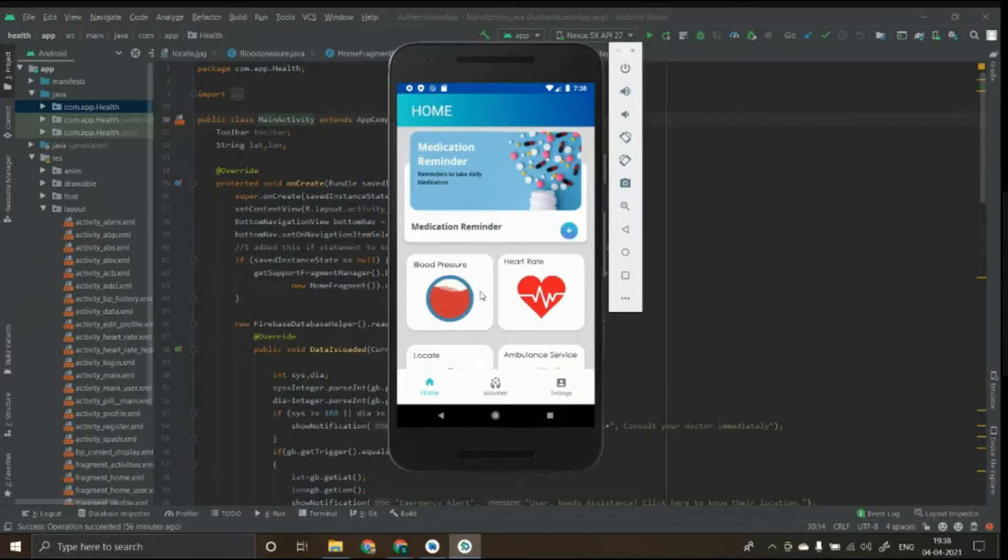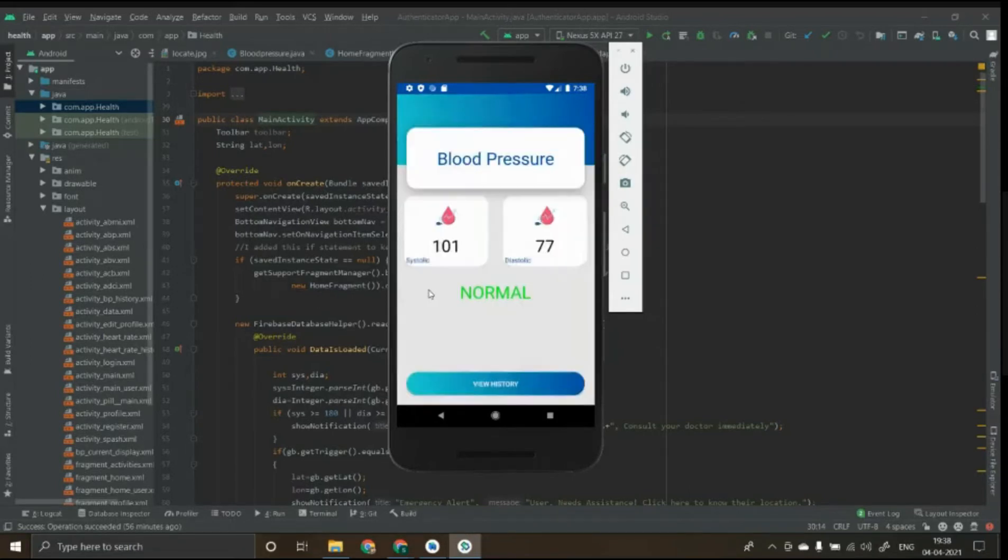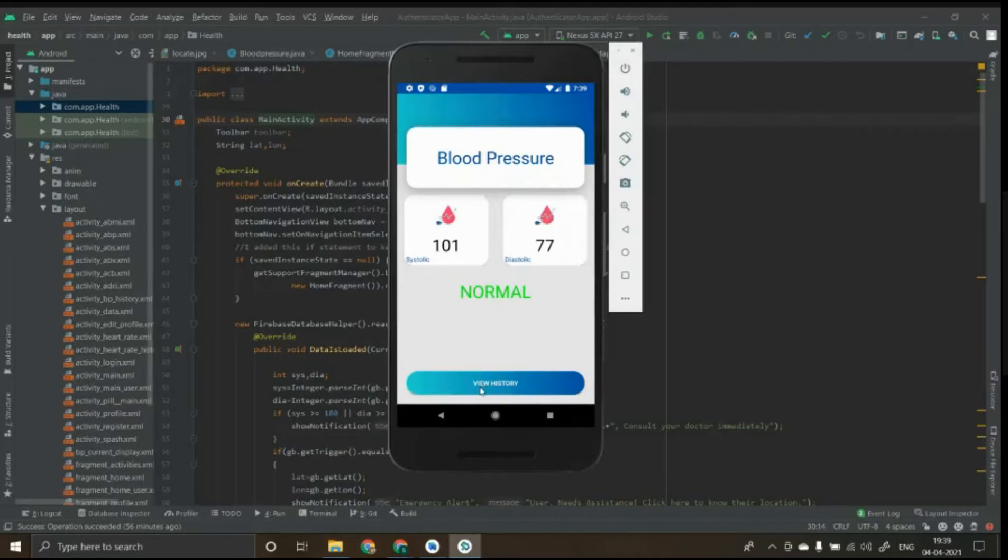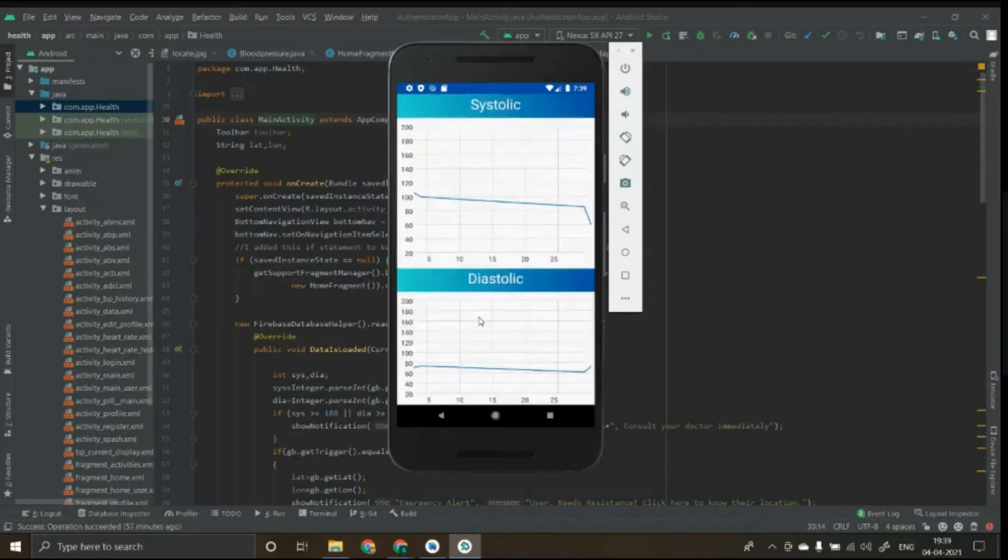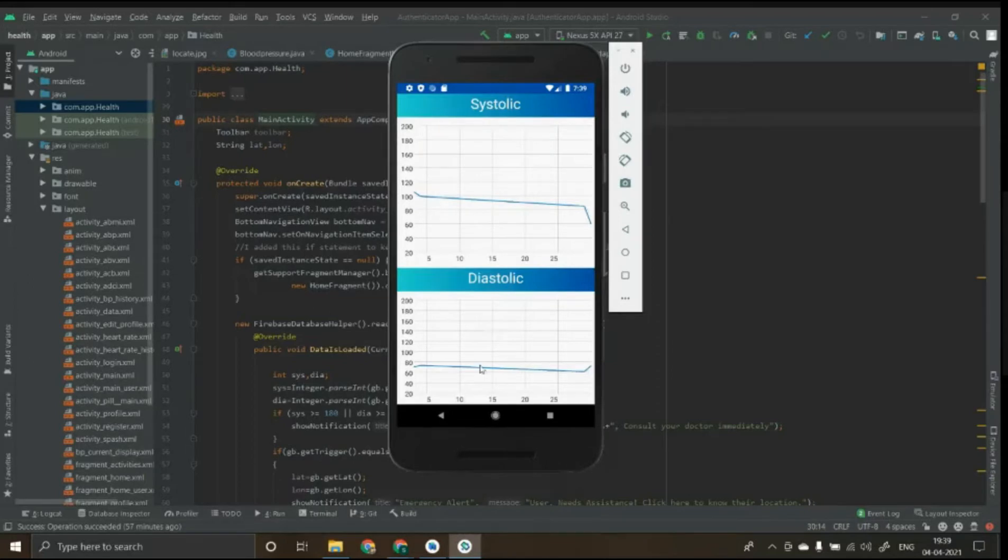The blood pressure module shows the systolic and diastolic pressures taken during the last reading. And the history option is available wherein the history can be viewed in a graphical pattern to track the variations. The same is applied for heart rate as shown.